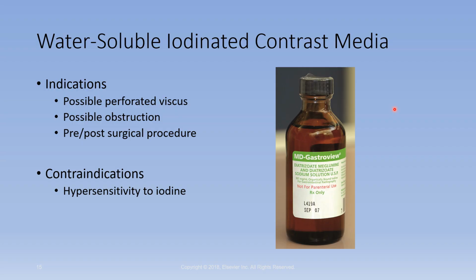All right, so this is the water-soluble iodinated contrast, atomic number 53. It is also a positive contrast media. It is radiopaque, and it would cause absorption versus scatter. It would be more likely that you would have absorption. That's why it shows up bright on our X-ray images. But if the patient has an iodine allergy, then they could not have this, meaning you would have to let the radiologist know that, and they would have to figure out how they would do the exam, because it would need to be done a little bit differently.